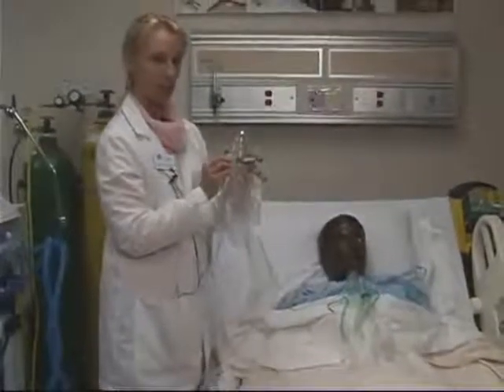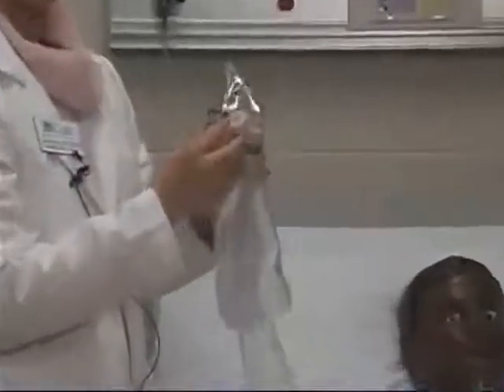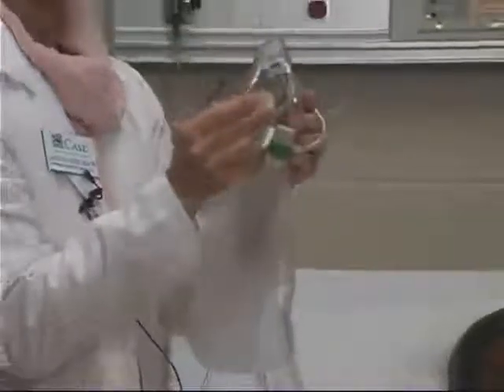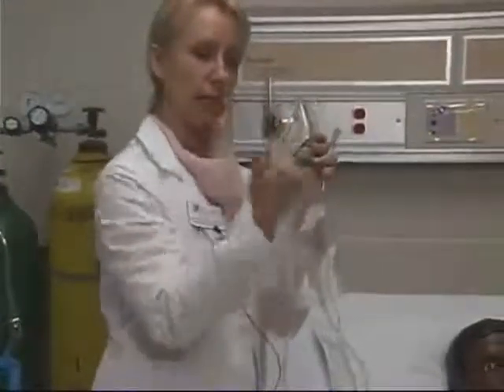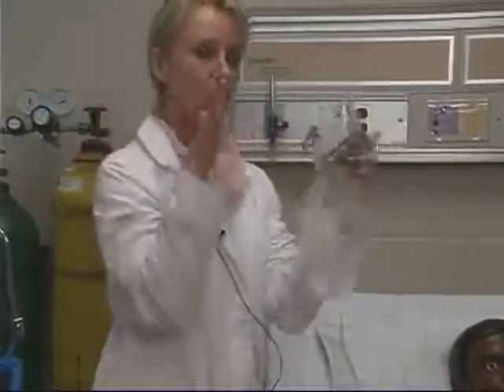Another difference with this mask is that on the side you will see one of these rubber flaps. You probably will not see another one on the other side, and here's why. If something should happen to the oxygen source, where the tubing is kinked under the patient or in the bed, or it disconnects from the oxygen source, and they are no longer receiving oxygen, and if there were two rubber flaps on here, if this was a tight, properly tight seal on the patient's face, when the patient inhales and no oxygen is coming in through its only source, which would be the bag, these two flaps, as the patient inhales, will push against the mask and it will not allow room air to enter the mask.